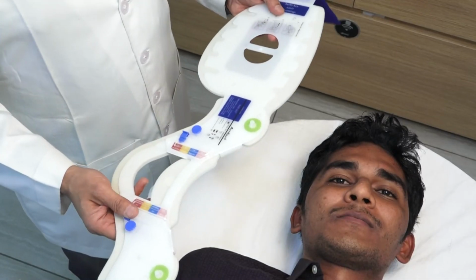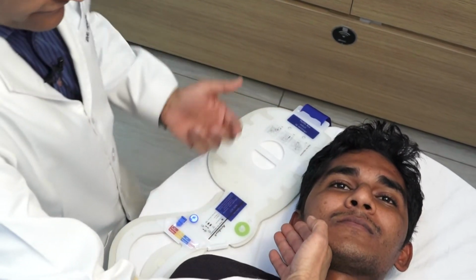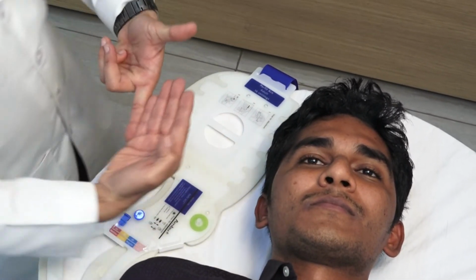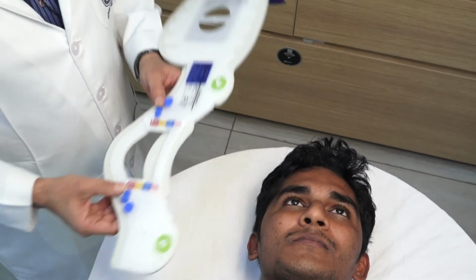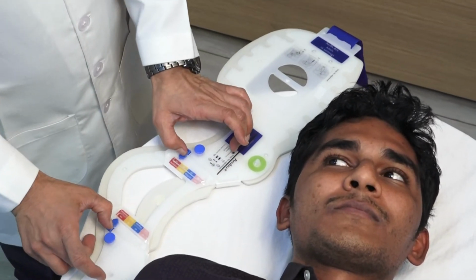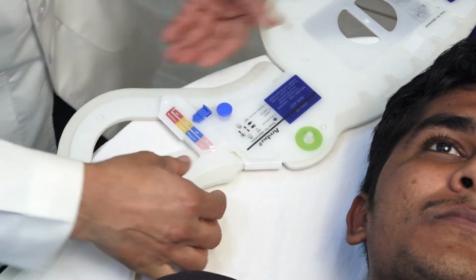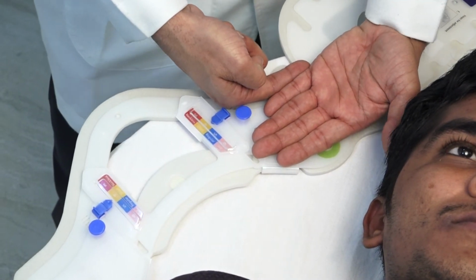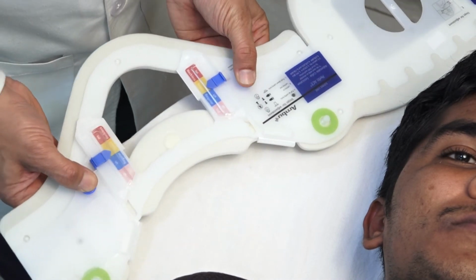Now I'll demonstrate how to use this adjustable cervical collar. The size determination remains the same, and we know that this patient fits a cervical collar of nearly 5 finger breadth here. This collar comes in the default setting of small size. What we have to do here is open the locks, push back the keys here, and adjust the height of the cervical collar by pulling these flaps apart. So this should be nearly 5 fingers here. Once this is at 5 fingers, I'll push these keys back and lock it like this.